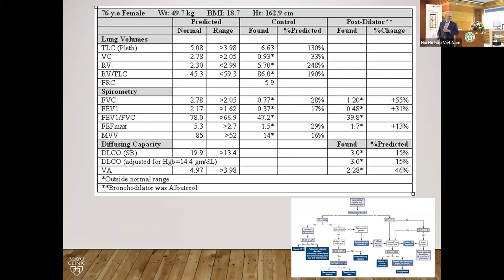No. The next thing we go to is the FVC, right? So that's the next breakpoint. The FVC is reduced. So spirometry suggests that there is a possible restriction pattern. But we know that about 50% of the time, if spirometry suggests restriction, that is not true.